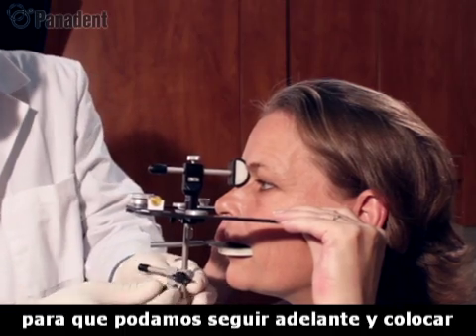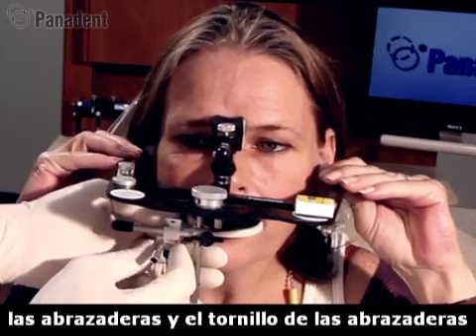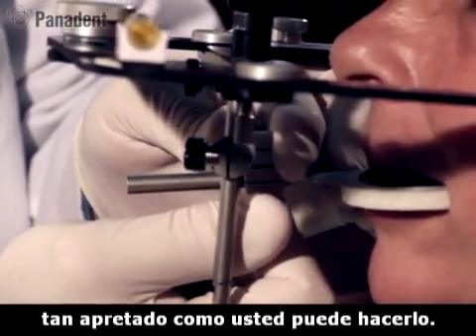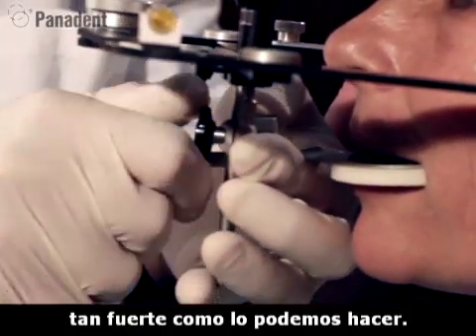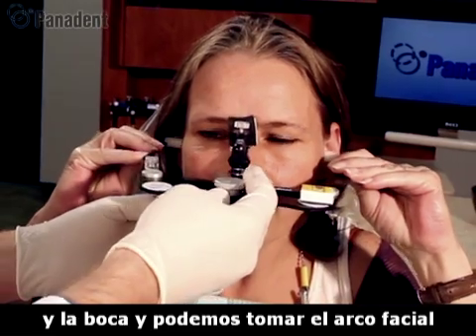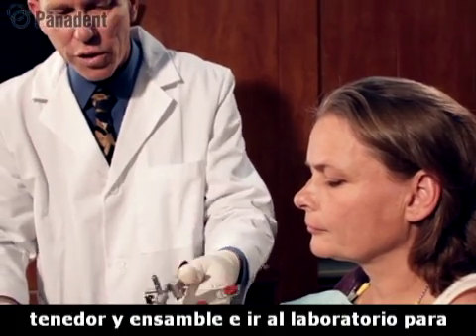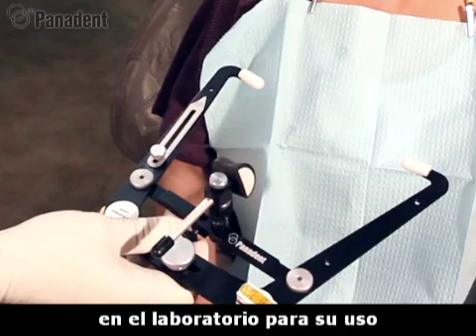Now with our hands free, we go ahead and attach the clamps, swinging them so the clamp goes all the way towards the patient. I like to grab that clamp to offset any torque and tighten both screws really, really tight — as tight as you can make them. Then we tighten the vertical post as tight as you can. I loosen the large screw and the nasion, have the patient open their mouth, pull it out of their ears, and take the face bow downward and forward away from the patient. At this point I loosen the little screw which releases the bite fork assembly, which goes to the laboratory for mounting the maxillary cast. The face bow can be cleaned and stayed in the operatory for use with the next patient.